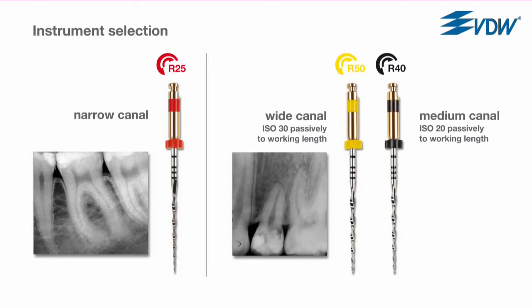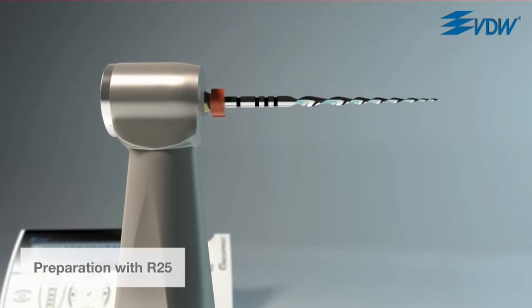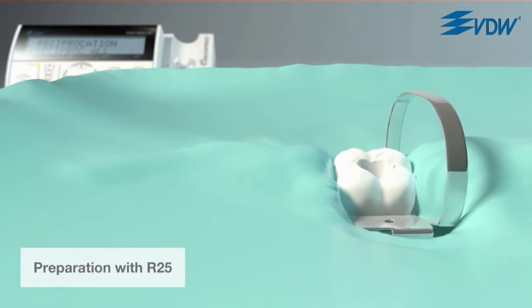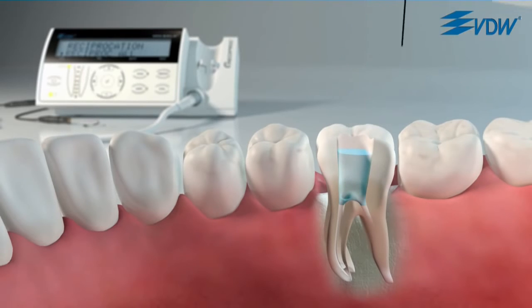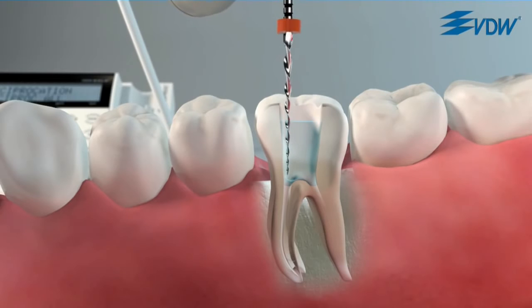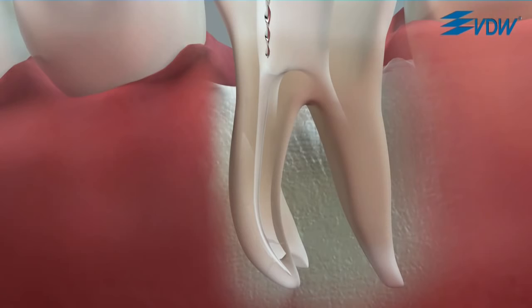A prerequisite for preparation is a straight line access at the root canal entrance. Estimate the root canal length with the help of a radiograph and set the silicone stopper to 2/3 of the estimated length. Place irrigant in the access cavity. And introduce the instrument into the canal. Move the instrument in a slow in and out pecking motion. It is important that very little pressure is applied apically.